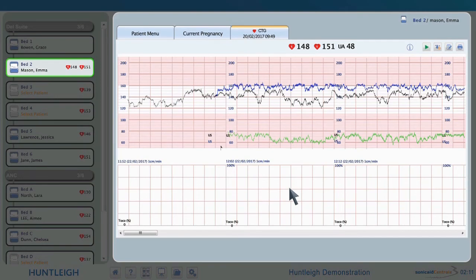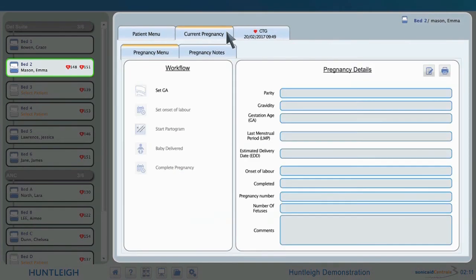A live trace can be displayed at any time by simply clicking on the bed from the left-hand side. By clicking on the current pregnancy, we can see any pregnancy details. The workflow allows us to enter the gestational age, enter the time the labour starts, and if the partogram option is purchased, the partogram can also be started.